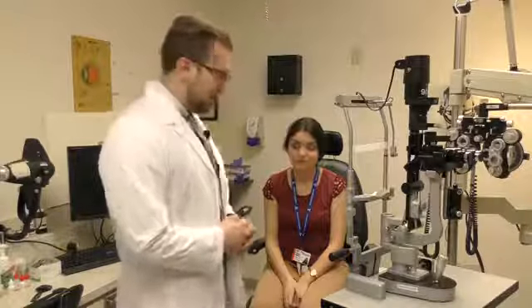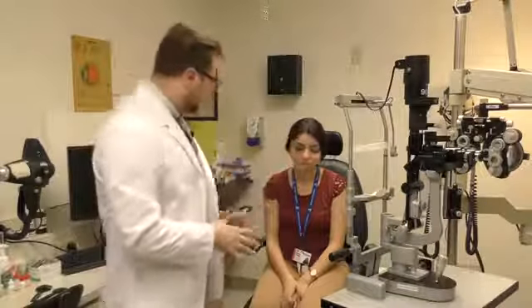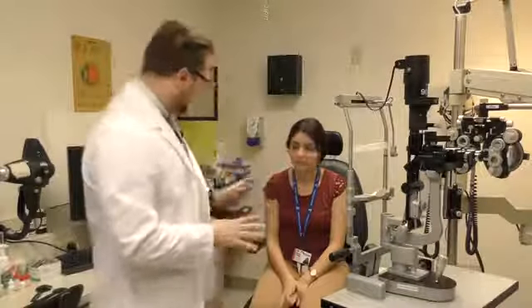Okay. So to begin, we have the patient seated. Make sure that they're comfortable in the chair. Okay, everything's great. I'm comfortable. You're doing well. Yeah. Good.